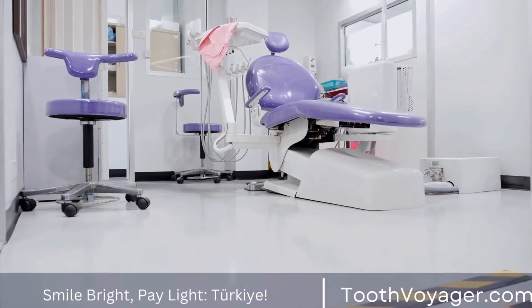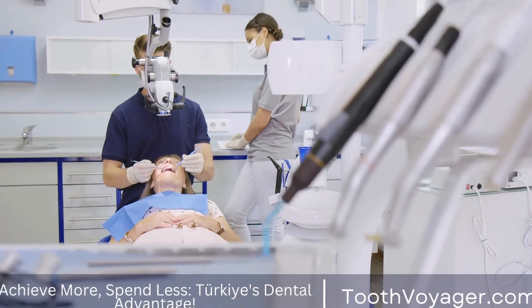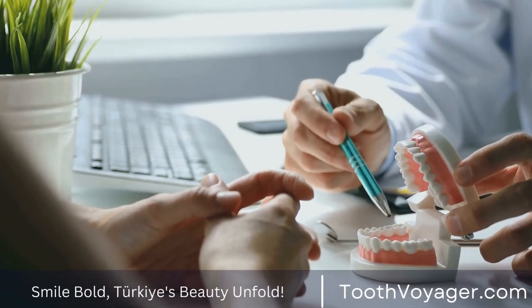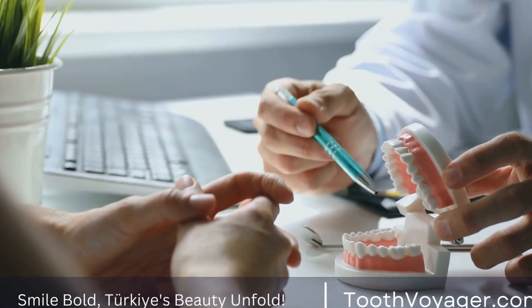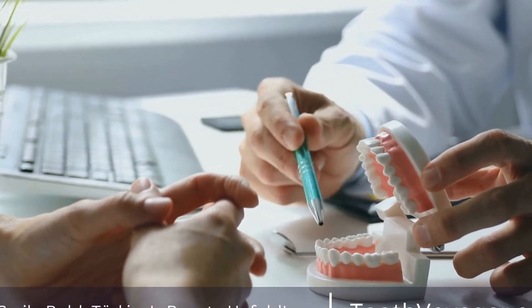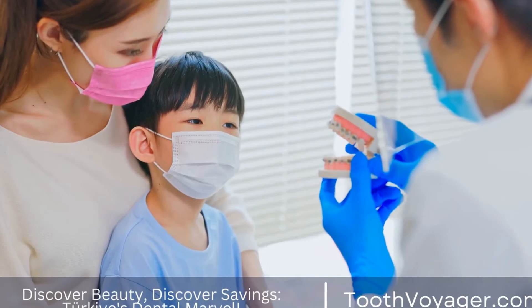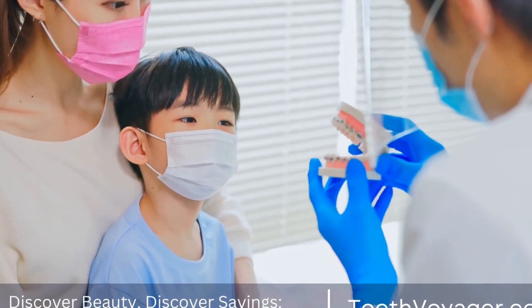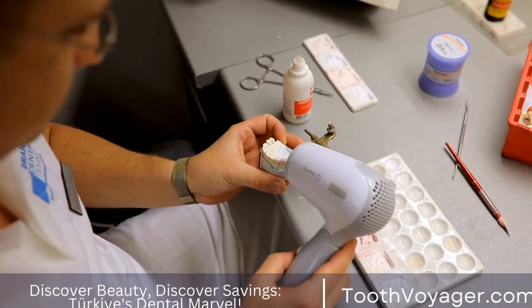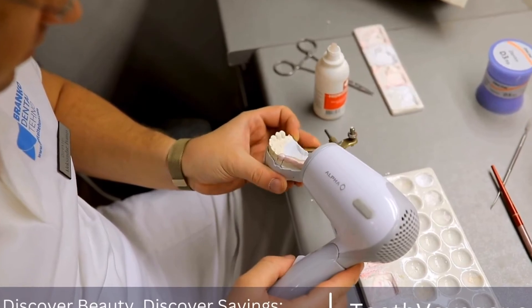Traditional dental implants are the most common type of dental implants used today. They consist of a titanium post that is surgically placed into the jawbone to act as a replacement for the tooth root. Once the post is integrated with the bone, a crown is attached to the top to complete the restoration. Traditional dental implants are known for their durability and longevity, lasting for many years with proper care.